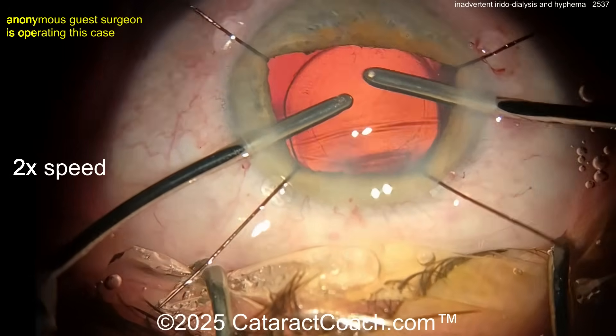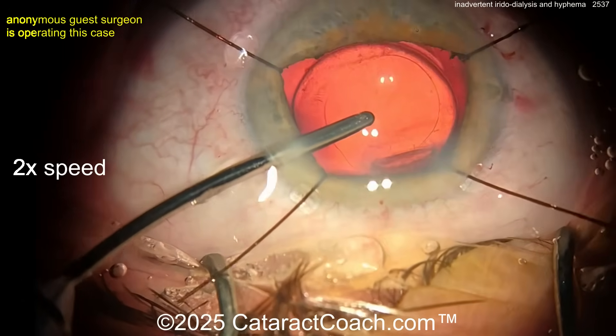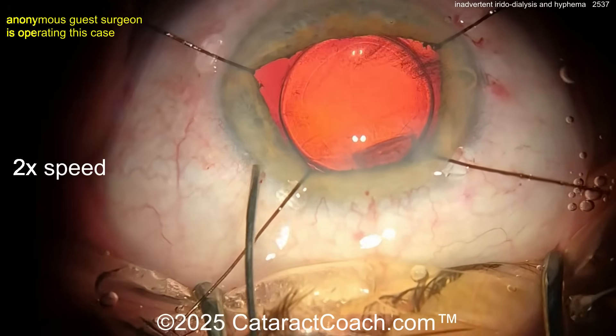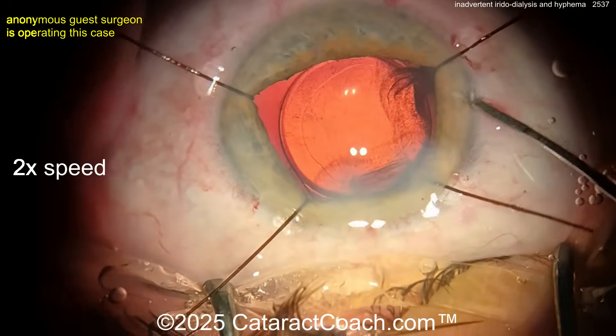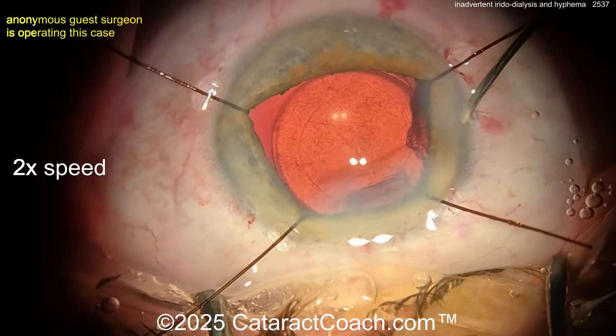It's not too bad — you can just finish the case. But look at that beautiful rhexis and lens in the capsular bag. Now look carefully: you've got a hyphema. There's some bleeding from that iris. More hyphema there — it's not a huge hyphema, just a little bit.